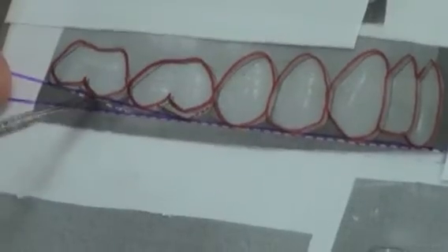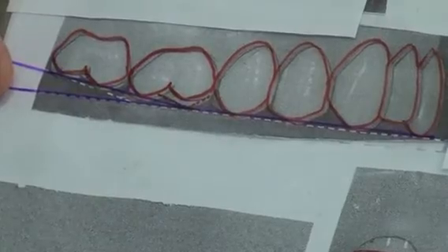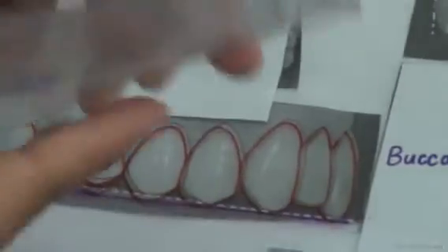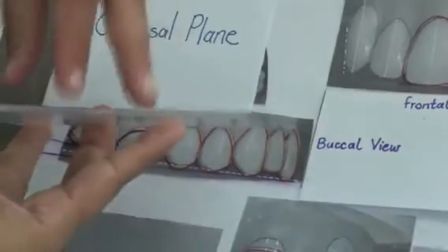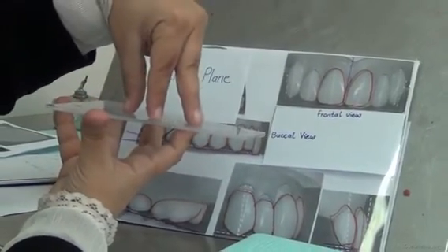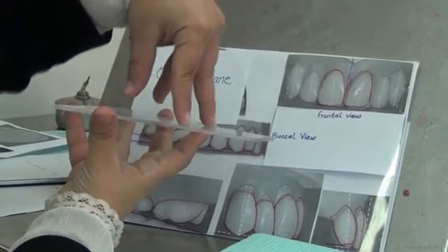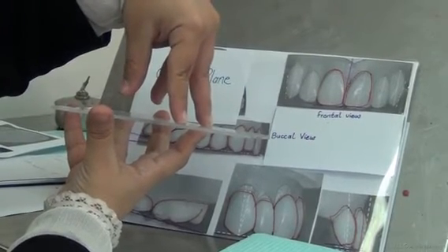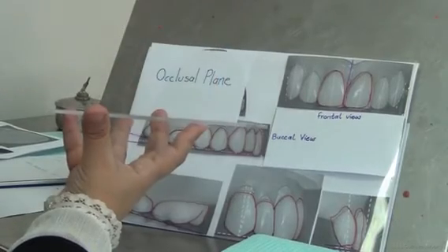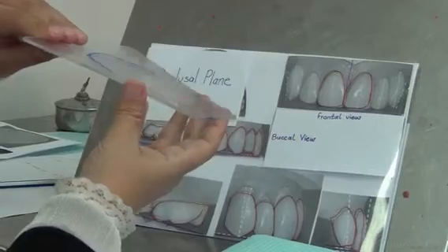These cusps are all in one line when we set the teeth. So whenever you're setting the molar on the glass slab, suppose this is the molar, whenever we set the first molar on the glass slab, we first put 4 cusps on. But then, when we want to shift, we shift distally, we raise it distally to make the curve of Spee, and then we raise it buccally to create what we call the curve of Wilson. So the molar plane is curved distally and buccally.